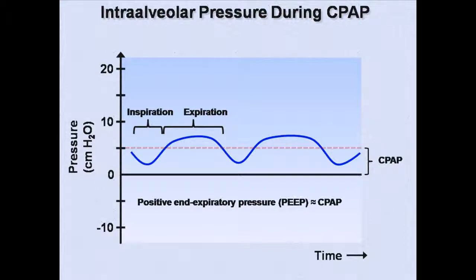Therefore, it is indicated strictly for pure hypoxic failure, as might be seen with heart failure. CPAP also has more mechanical benefits in heart failure by reducing afterload through a reduction in the transmural pressure across the wall of the heart. This effect will also be discussed more in lectures 8 and 11.